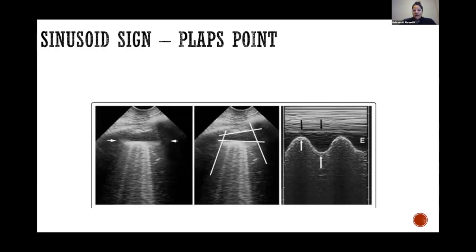Okay, so again, to summarize pleural effusion findings, it's an anechoic dependent pattern, and depending on if you're using M-mode, you can see a sinusoidal pattern. And if you're utilizing your cardiac probe and looking at other zones, 1, 2, 3, it might look like this, where you see what looks like your pleural line. You see that anechoic space and what looks like a trapezoidal shape.